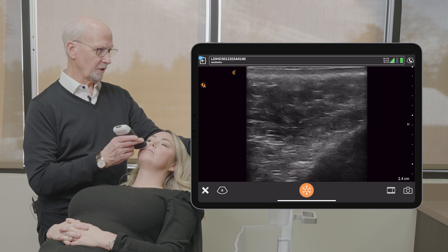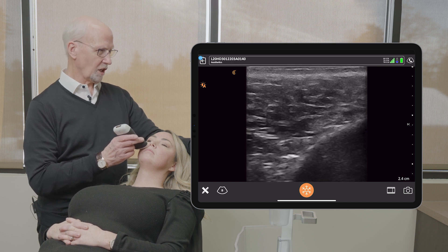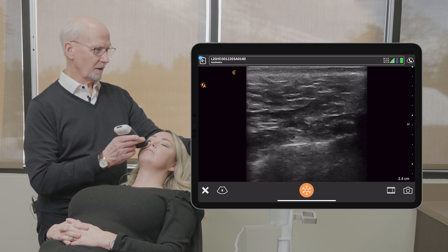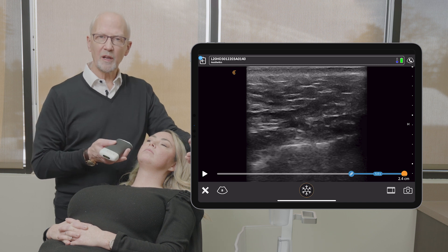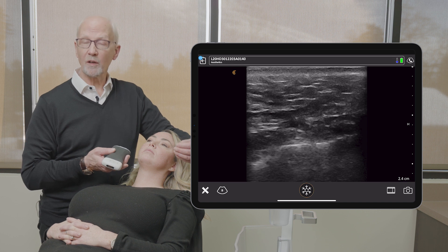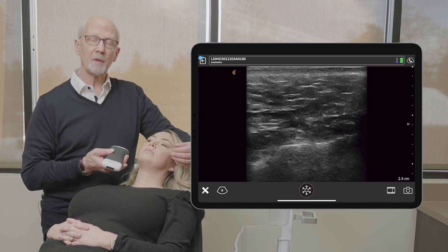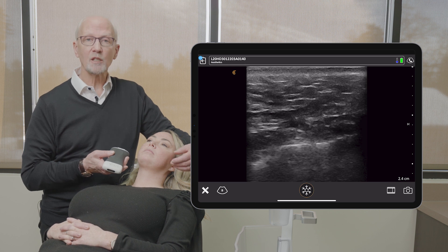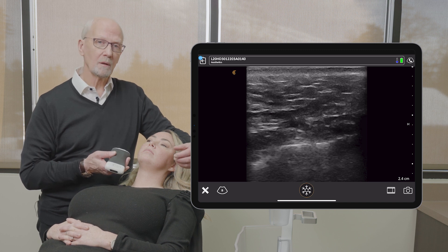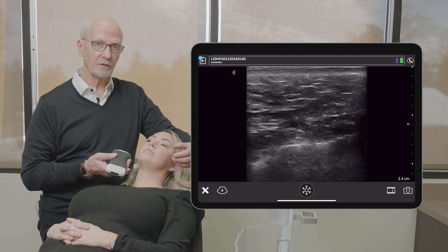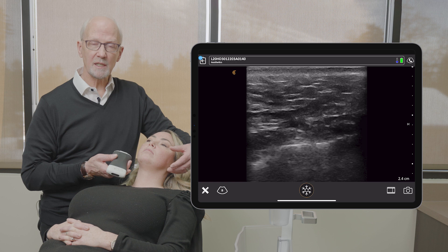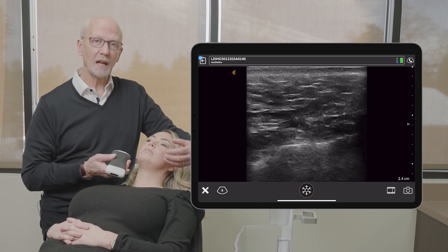It's very important for us to check our patients before we inject, because we need to know what their vascular structure is before we inject in an area. If we come back to look after we've injected and we don't know where the vessels were beforehand, we'll be surprised and perhaps confused as to why we're not seeing vessels — because if they didn't have them before, they're not going to suddenly appear. So checking before is really important if you're going to be using ultrasound imaging as part of your approach to patient safety, results, and efficacy.